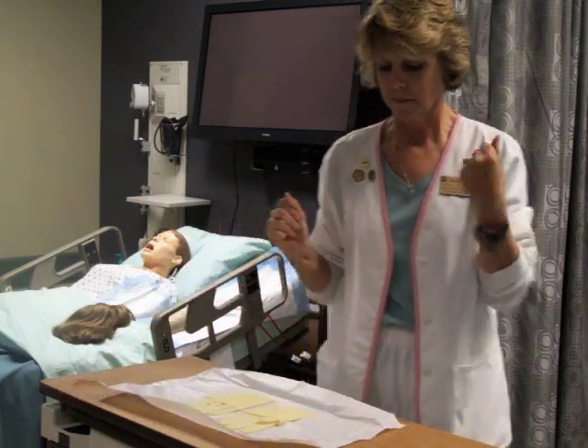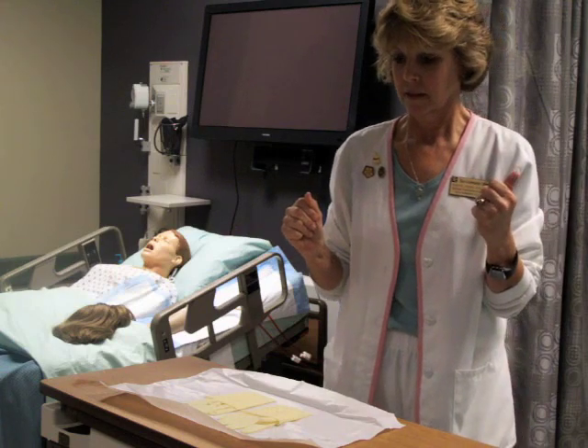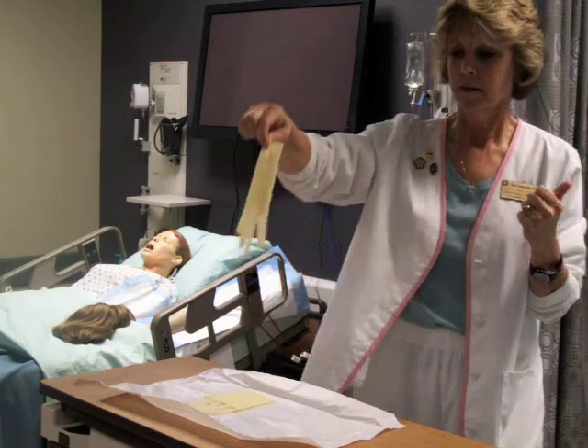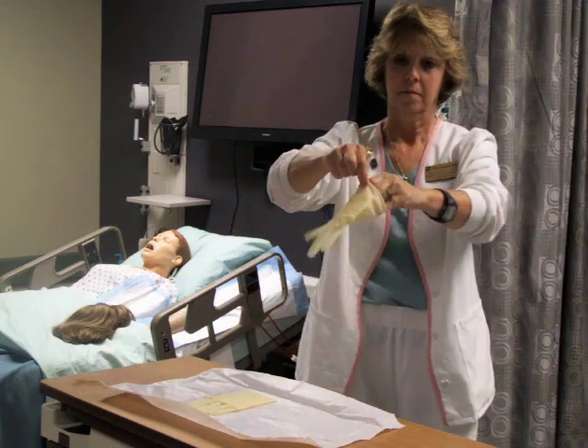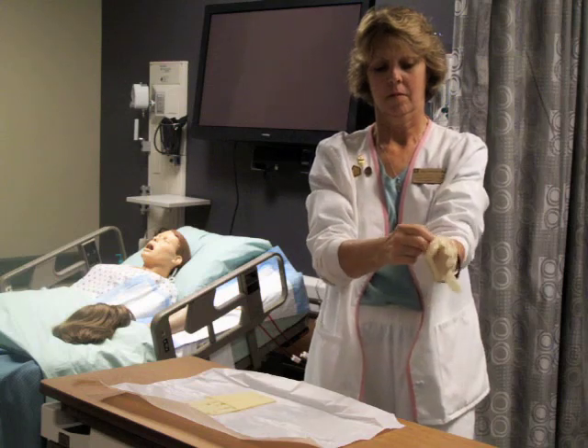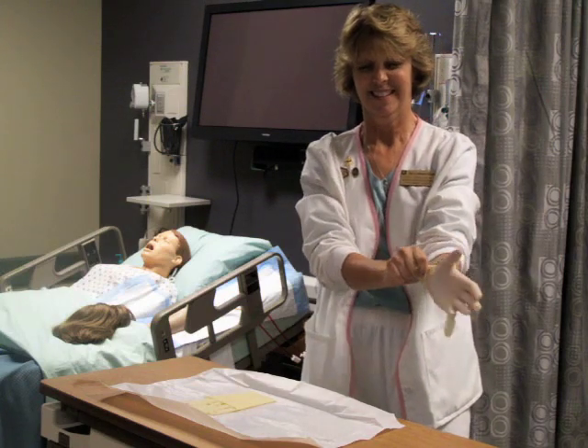As you don your first glove, go straight in and pick straight up the glove, back away, then insert your hand into the glove, being careful to maintain the sterility of the glove.